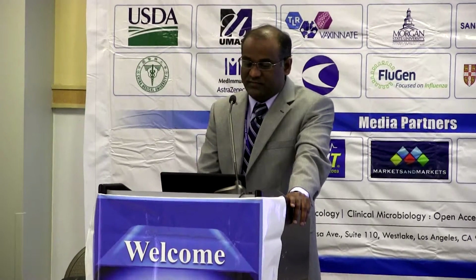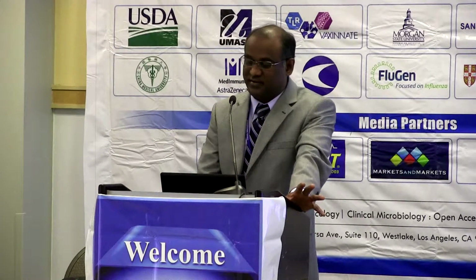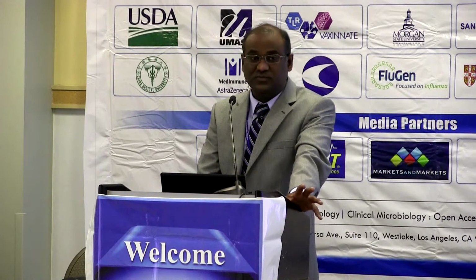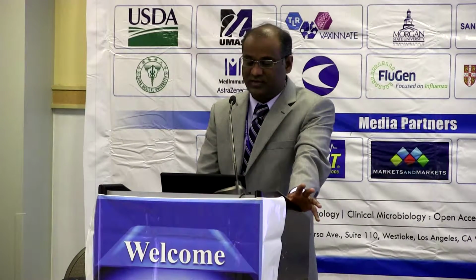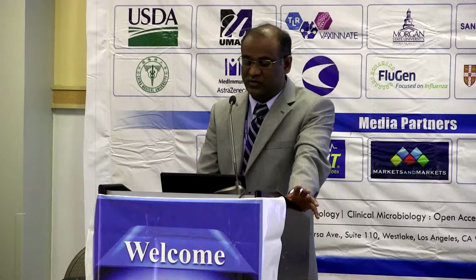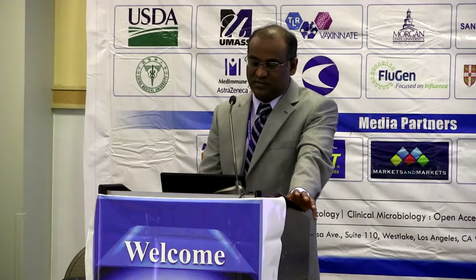The positive predictive value or negative predictive value usually takes the pretest probability or the clinical information in hand, and that tells you the likelihood that patients with a positive result are correctly diagnosed as positive, and the proportion of patients with negative test results who are correctly diagnosed as negative. So with that in mind, let's take a flu test.